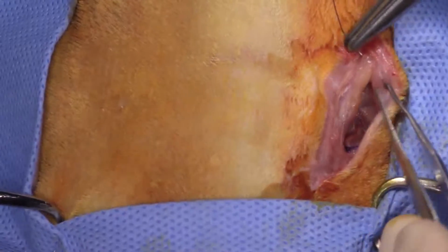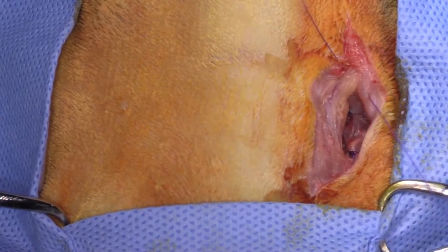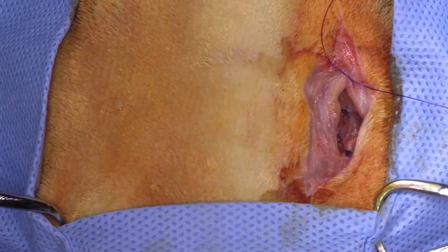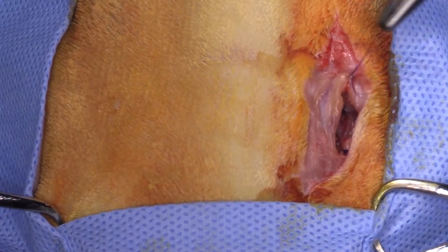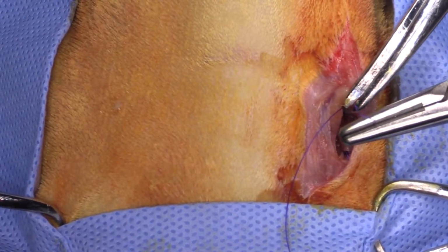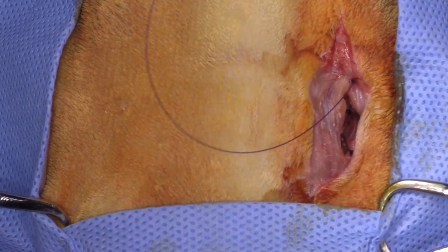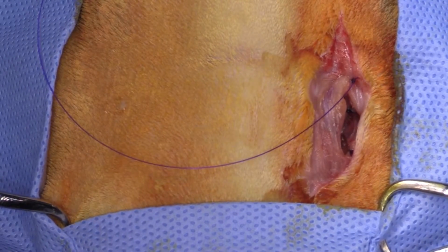Just watching out for my linguofacial vein. Can I get some 4-0 monosin, please? Just load that up on the other needle drivers, please, Eddie.